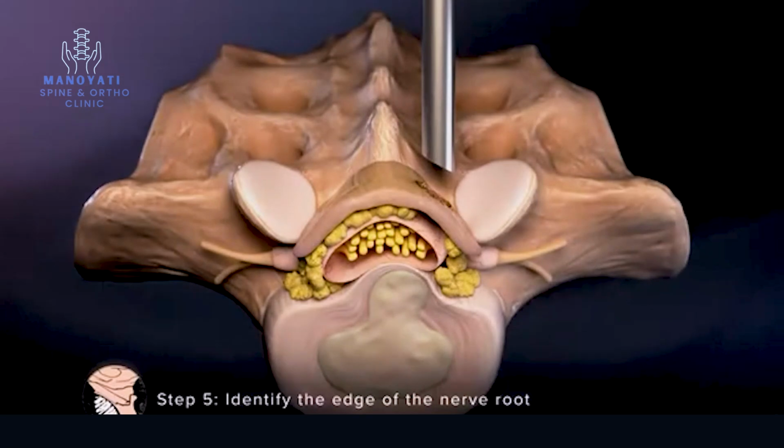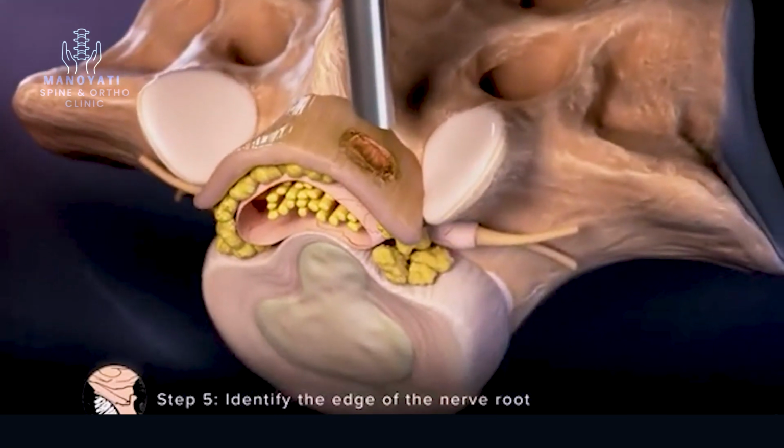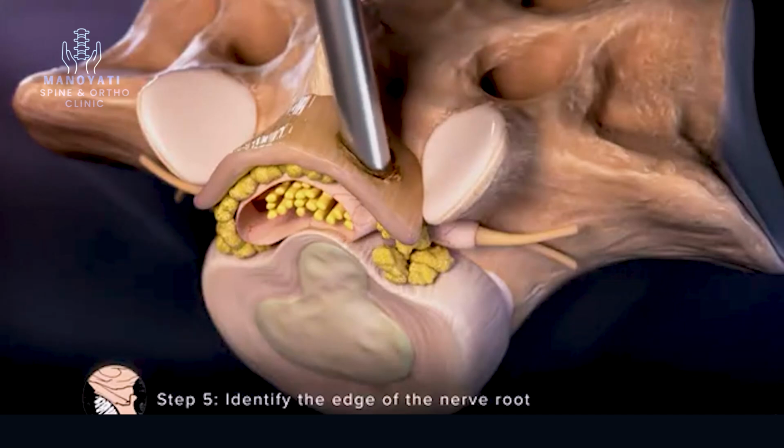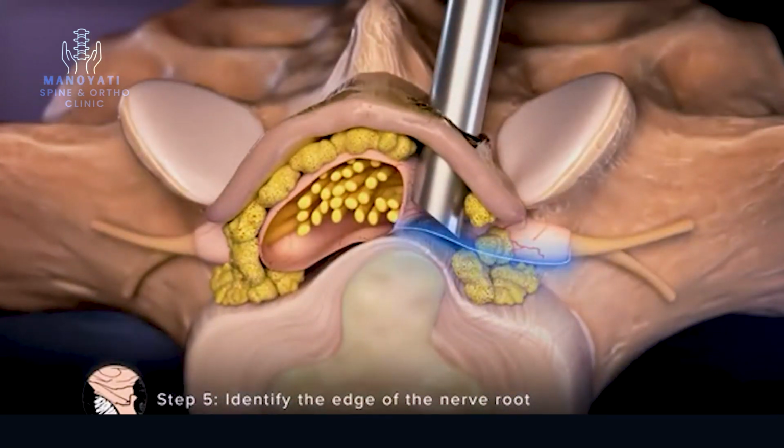Step 5. Identify the edge of the nerve root. Once a sufficient amount of ligament has been excised, slowly advance the cannula through the ligament and into the spinal canal with the bevel of the cannula facing medial, allowing the edge of the nerve root to be clearly visualized.